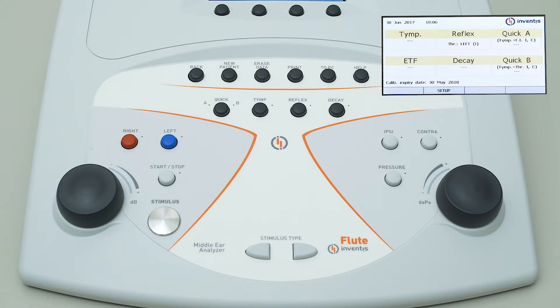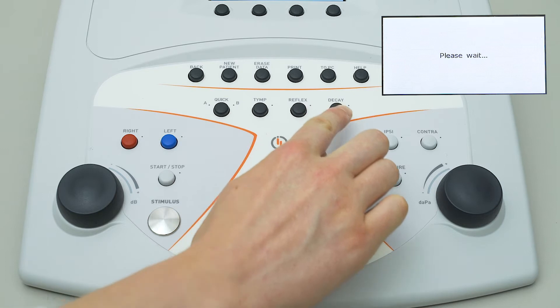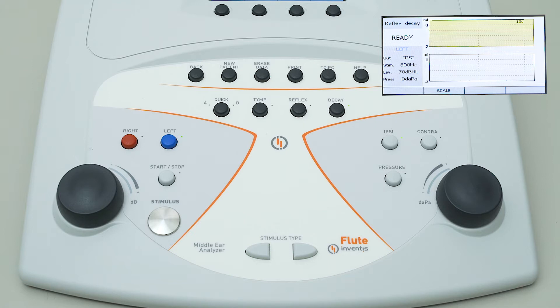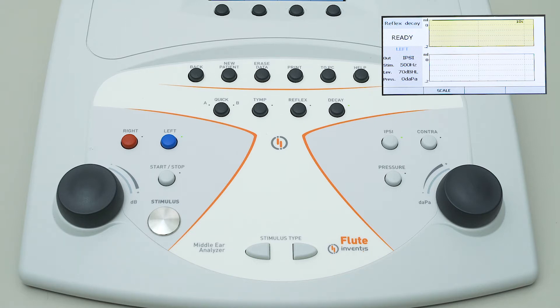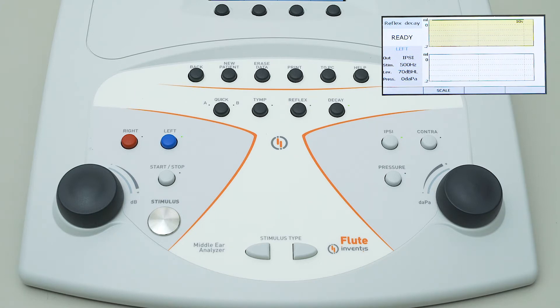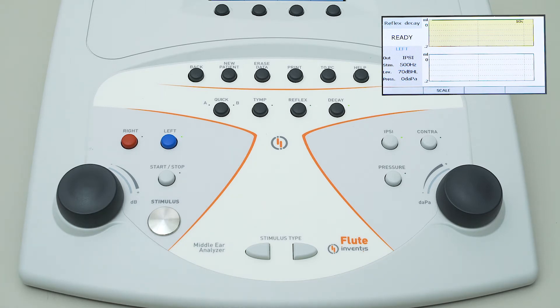To conduct the reflex decay test, the operator should simply press the dedicated button on the keyboard. The status of the probe and the progress of the test are indicated at the top left of the screen. Lower down, the screen shows information about the ear side under test, the ear canal pressure to be set, and the characteristics of the current stimulus.